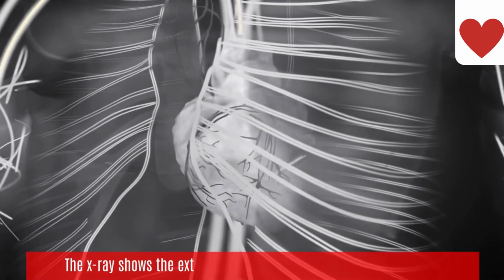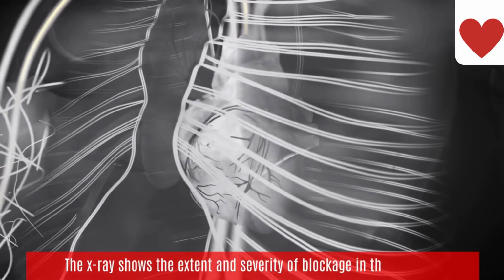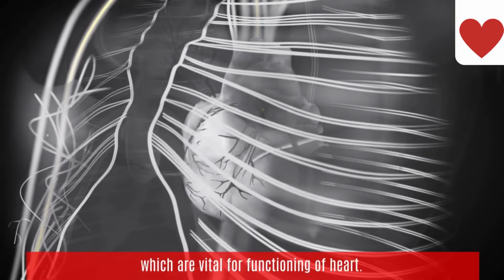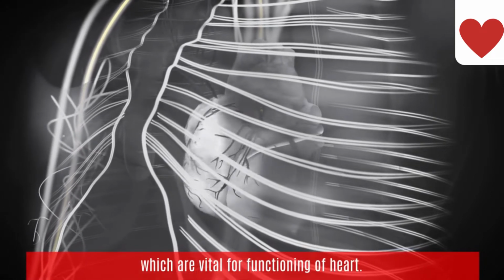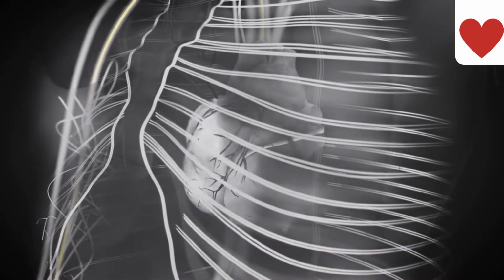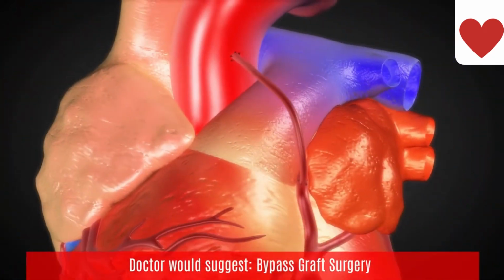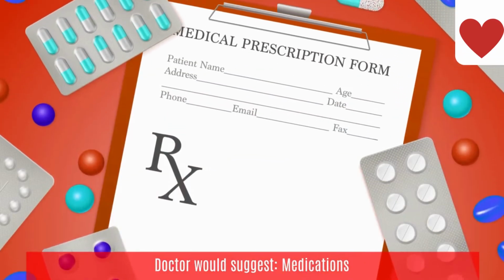This shows the extent and severity of blockage in the arteries, which are vital for functioning of heart. With this information, your doctor would suggest the treatment options. These may include angioplasty, bypass graft surgery, or medications.